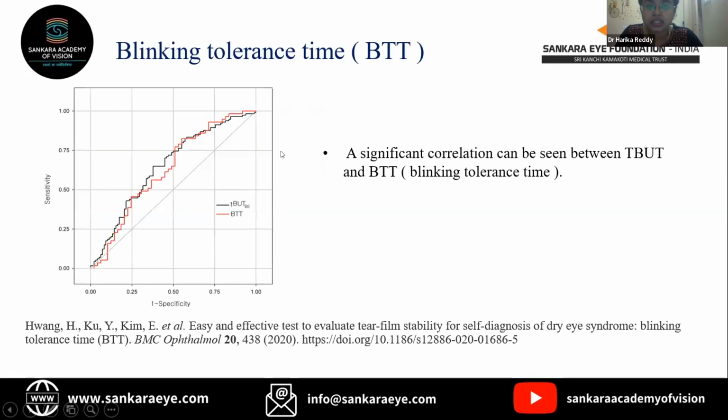Next is blinking tolerance time. It is a newer test. It is a simple and non-invasive test. Here we ask the patient to look at a distance of 3 meters, and the time is recorded from the first to the last blink. And there is quite a bit of correlation between the tear breakup time and the blinking tolerance time.